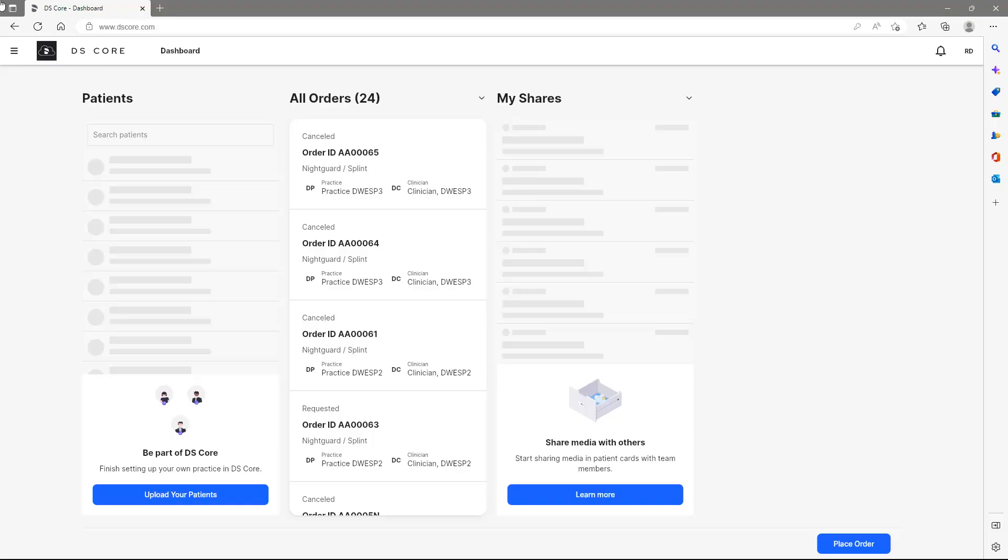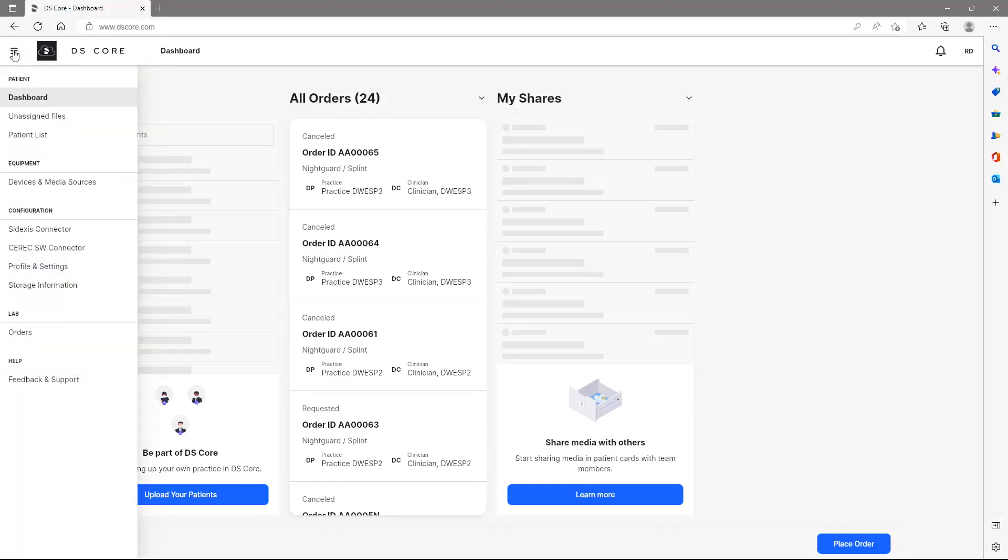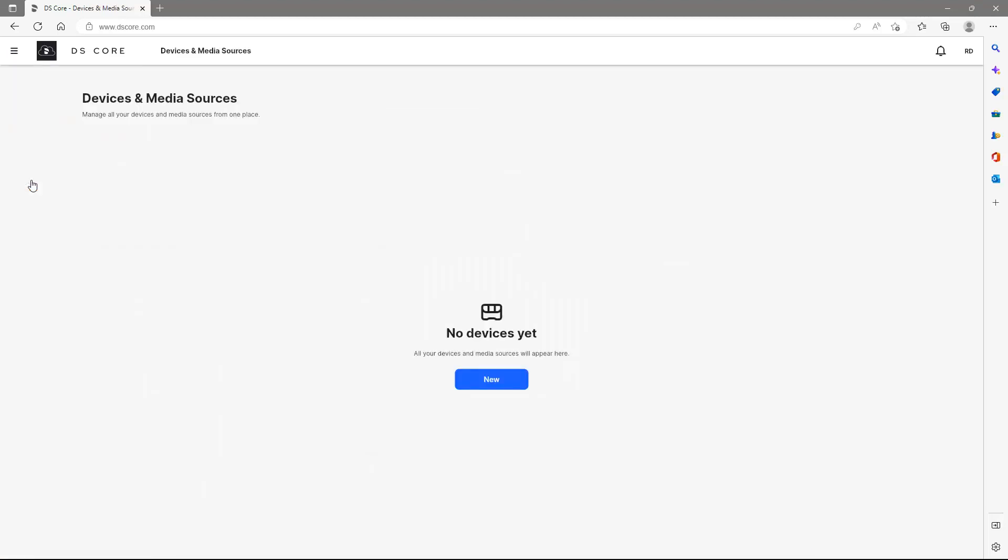After logging into our DS Core account, we open the menu. We tap on Devices and Media Sources and get informed that there is no device found yet. Therefore, we tap on New.